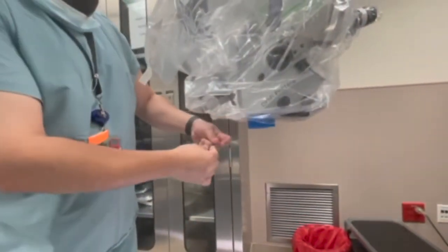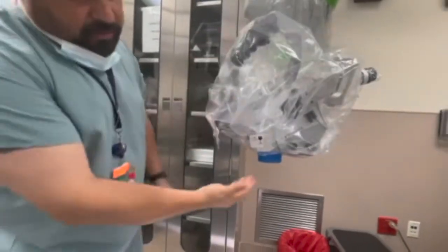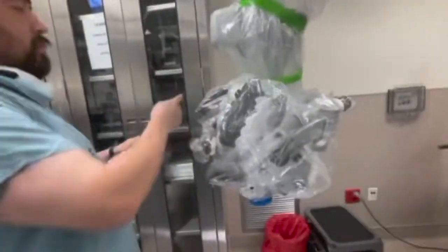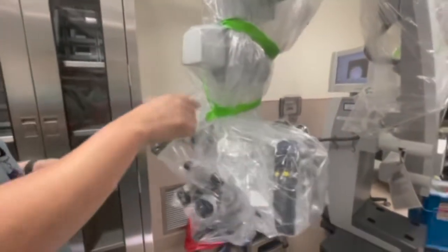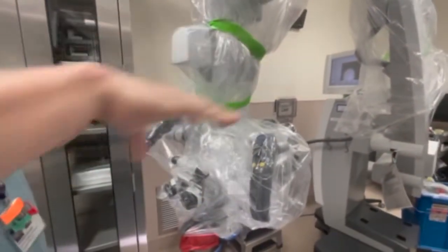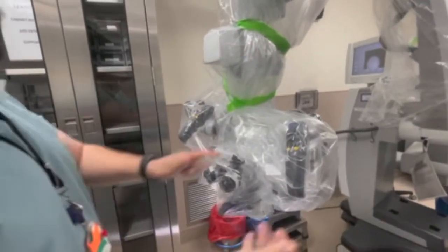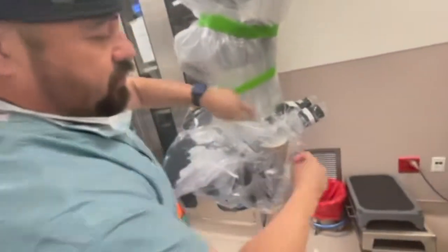You see? You wrap the rubber band right here and wrap it over the eyepiece. And look at that, perfect view. Now after that, you can put the rubber bands wherever you feel it needs it. Like right here and over here too. As long as the surgeon can hold the handpiece to move the scope, you're okay. Right here, you can put a rubber band, just like so.